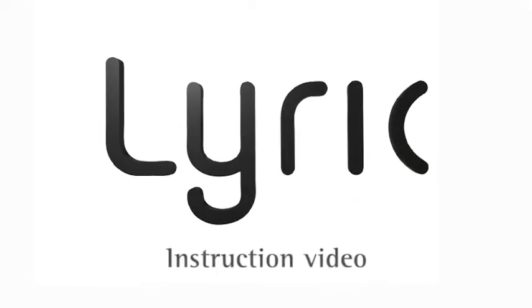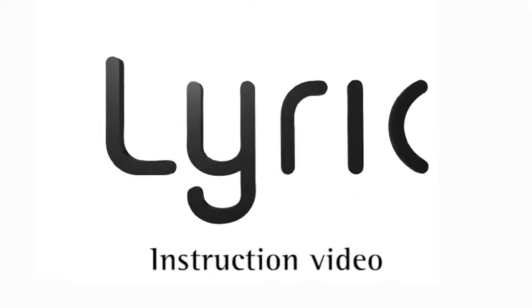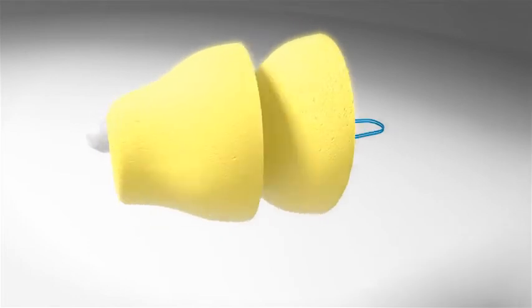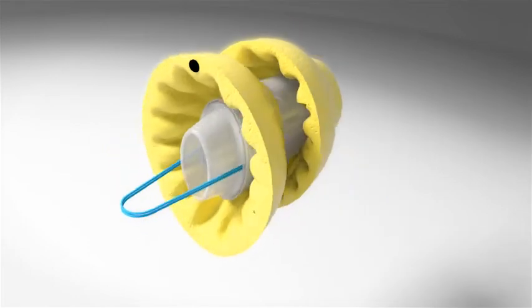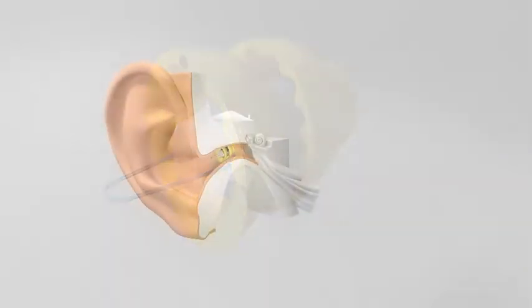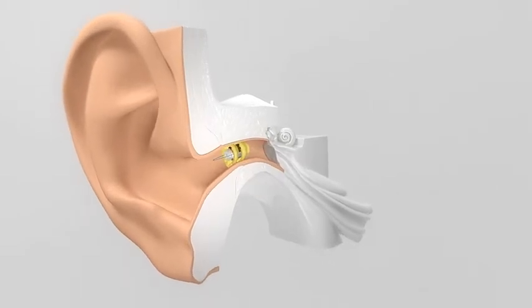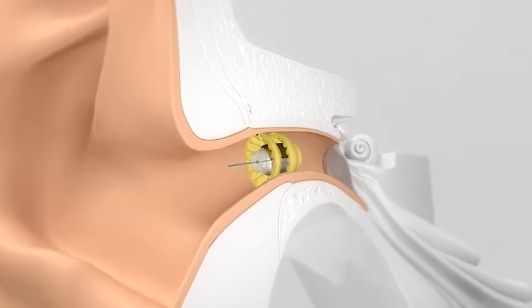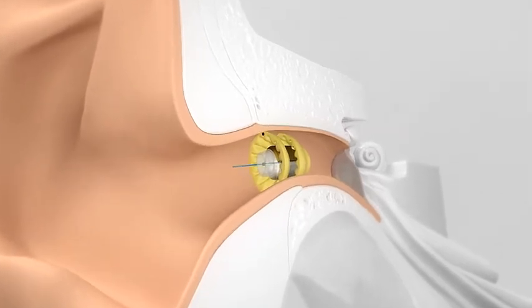This instructional video will demonstrate how to properly size and fit patients with the Lyric hearing device. Lyric is an extended wear hearing device that is placed deep in the ear canal. Lyric is available in 5 different sizes. This instructional video will show you how to measure the maximum depth of insertion, choose the correct device size, and place Lyric in the canal.